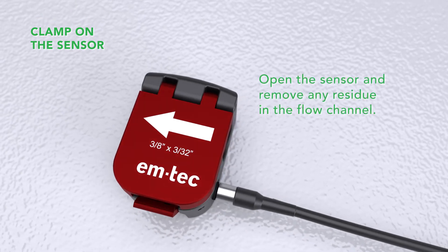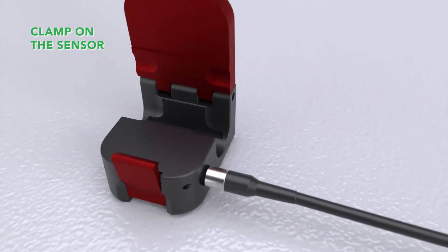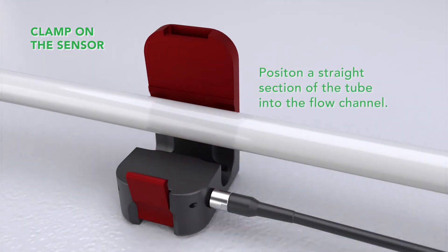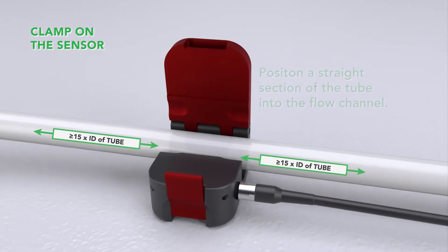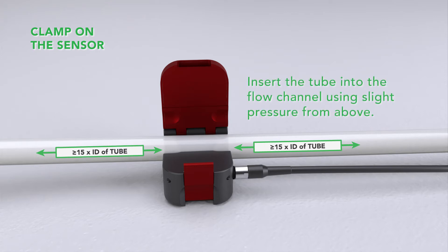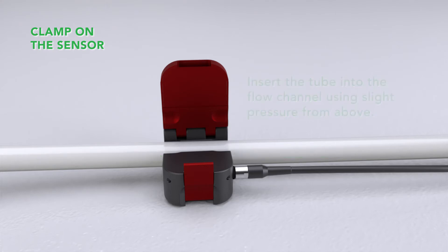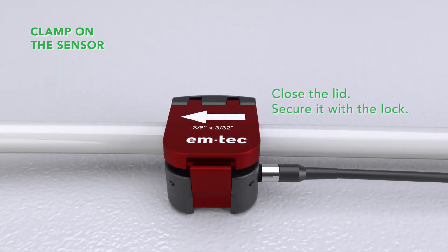Open the sensor and remove any residue in the flow channel. Once the flow channel is clean, position a straight section of the tube into the sensor's flow channel. We recommend an inlet section of 15 times the inner diameter of your tube on either side of the sensor. Insert the tube into the flow channel by using slight pressure from above, then close the lid and secure it with a lock.